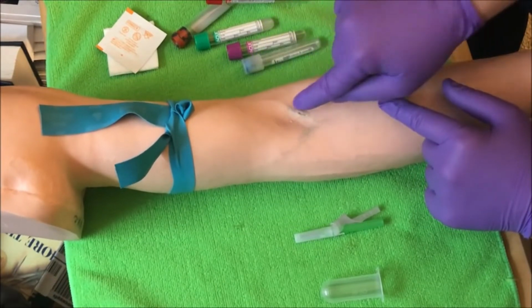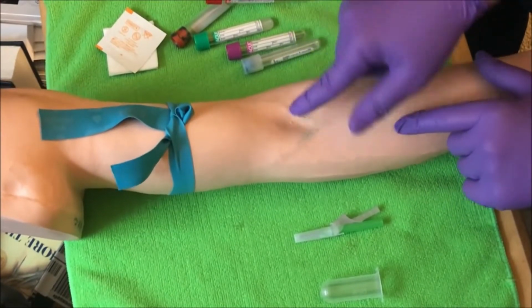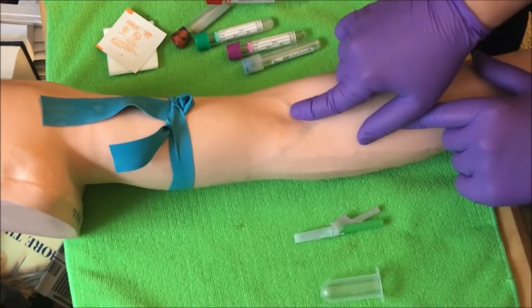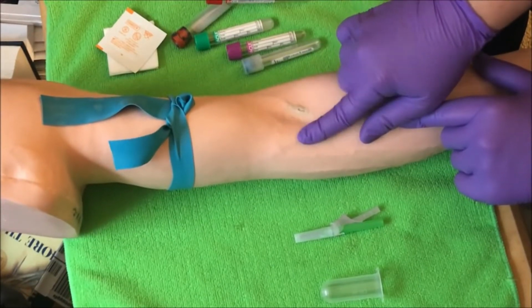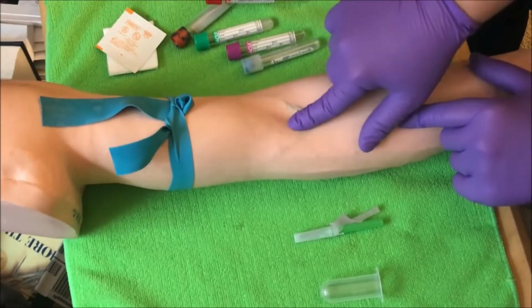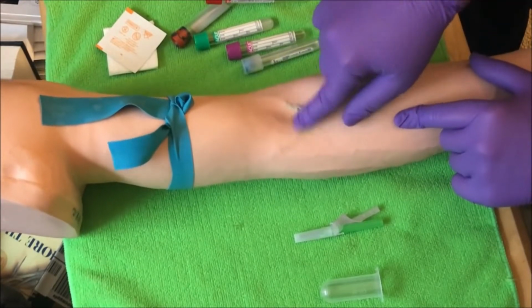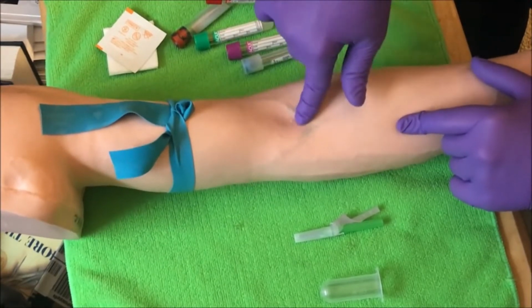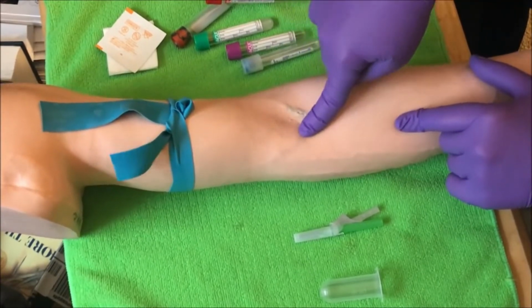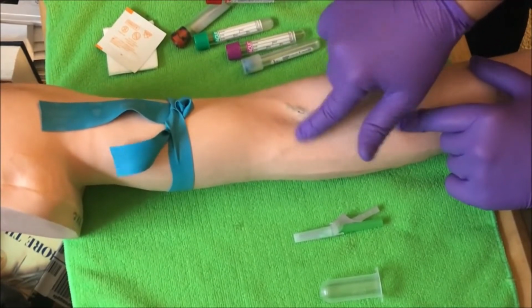My index finger or middle finger is fine, but here I like to palpate, push around, push down, feel for sponginess. I want to feel the depth of the vein. I want to feel the width of the vein to see how wide it is, if it's good for my 21 gauge needle. I want to feel how deep it is, because again, we have to look at 15 to 30 degrees only. We can't go anything above 30 degrees. So it's typically up to 30 degrees, or I like to say 15 to 30. So I palpate and feel for my vein in different directions, where the vein is going, how deep it is. And once I locate a vein, that's when I will get my equipment ready.